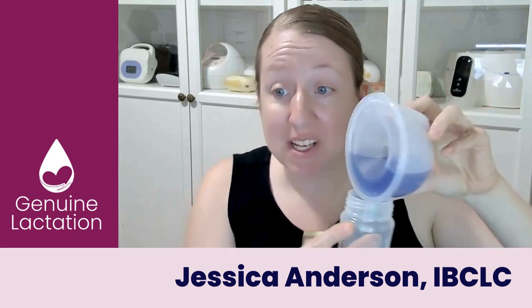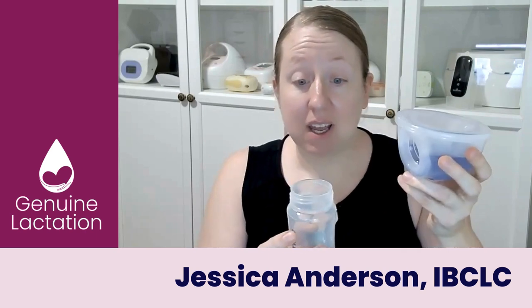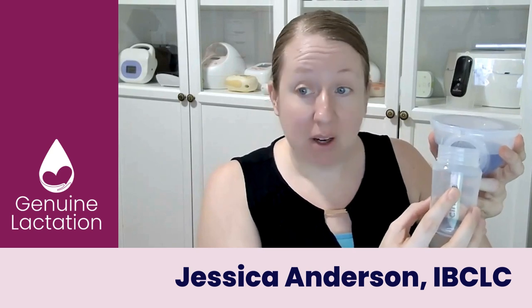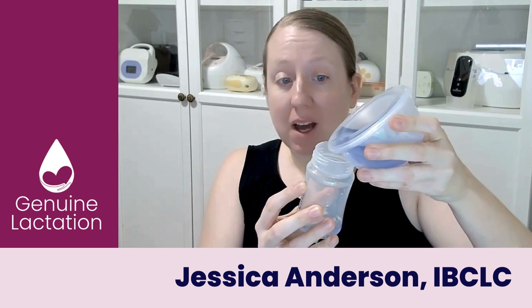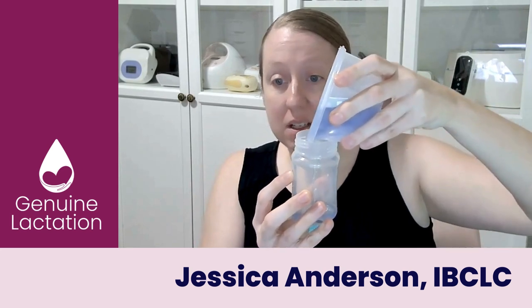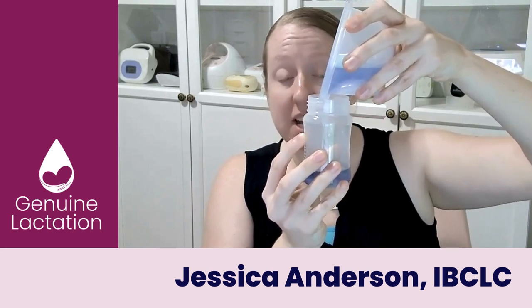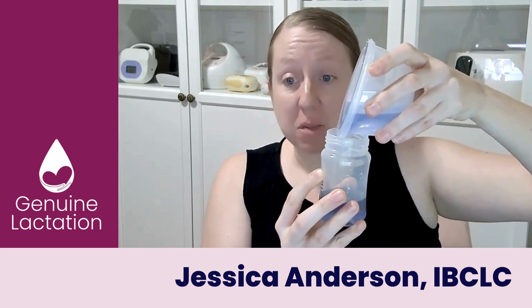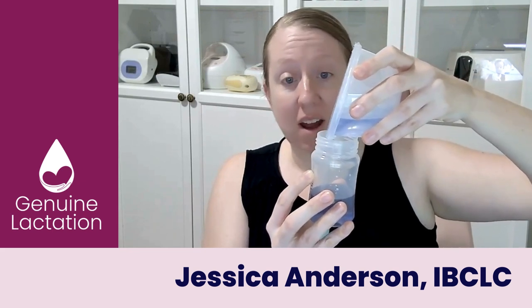There is still a little bit — it's hard to see in the back, but if you look way back there, there's still some in the duckbill. What we're going to do is take your top cup, turn it around. You're going to take your wide mouth bottle and put it in contact. I like to line mine up right to that little groove where the cap would sit. Tip the cup slowly — no mess. Keep it in contact. If you try and pour it from several inches above your bottle, there's going to be splash back because liquid when it hits a lip is going to go out of the way.